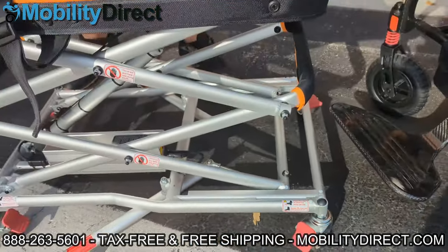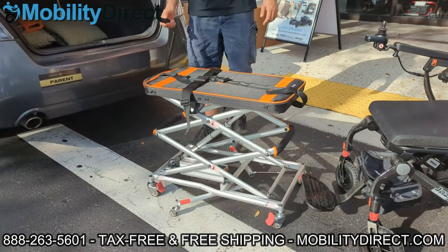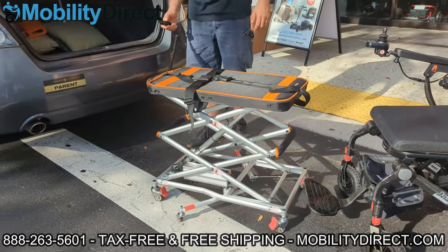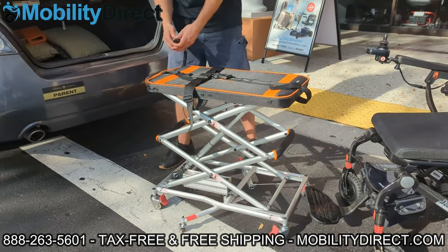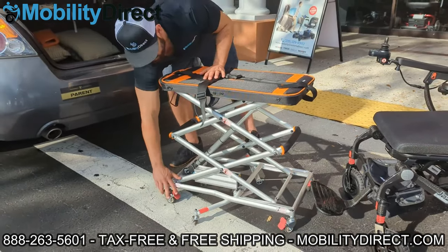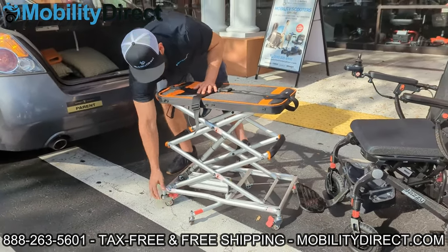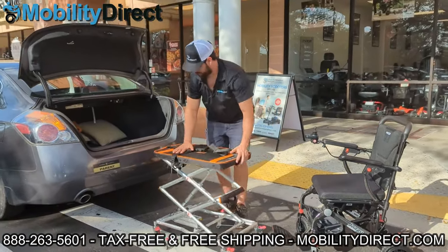There are little stoppers on each of the four outer corner wheels along the base — there's a total of six wheels, but four on the outside corners have stoppers. You can lock the wheels into position so that when you're using the lift to transport your wheelchair or scooter into the trunk of your car, it's not moving around. If you're on a ramp as well, it's useful to use those lockers.